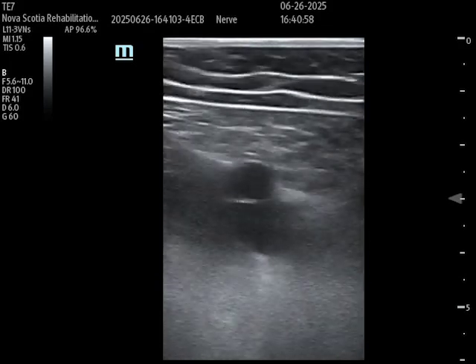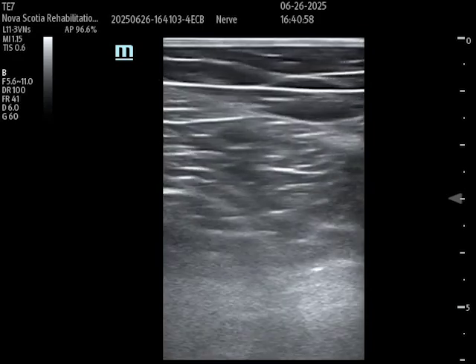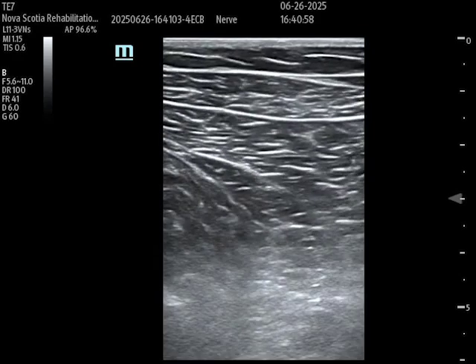So here we are. And then if I bring that probe now over medially, boom. There's our overlying gracilis. Deep to it is the adductor magnus that we want to target. And again, we might move the probe a little bit more distally at this level so that the gracilis tapers. And then for the adductor magnus, we can appreciate some of the contour of the semimembranosus, one of the hamstring muscles that we want to avoid. But again, I've shown you this just so that you're aware of the surrounding muscles.